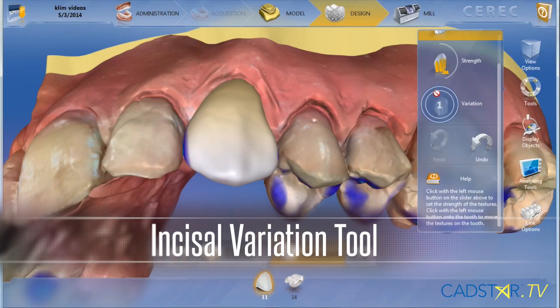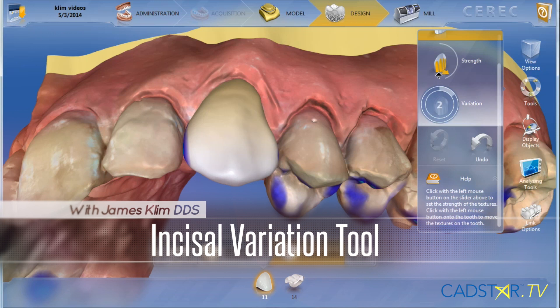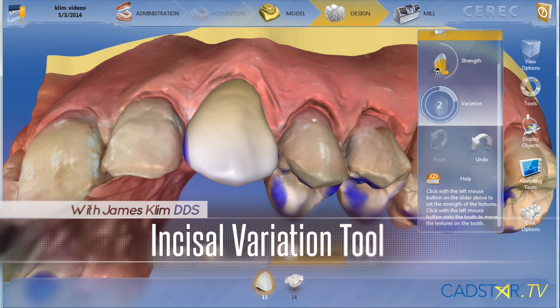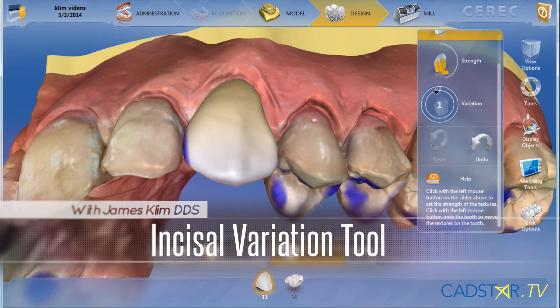In the Incisal Variation Tool, we're now in a new generation of that tool with the current software, but it's been around for a while.